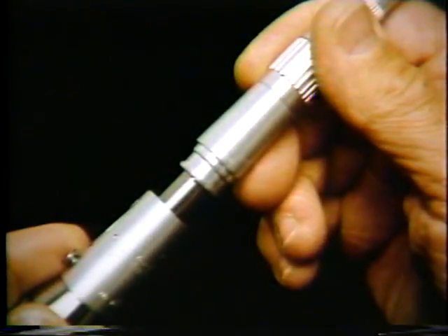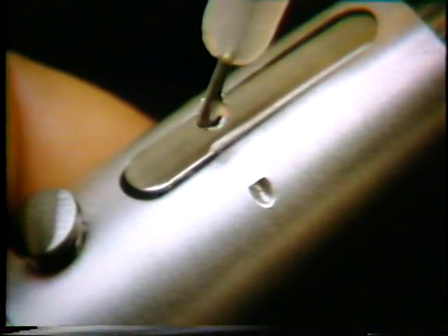Place 1 drop of True Torque conditioner on the nose to prevent wear when sliding the nose cone attachments on and off. Then apply 1 drop of oil on each side of the latch at the point where the pin passes through.